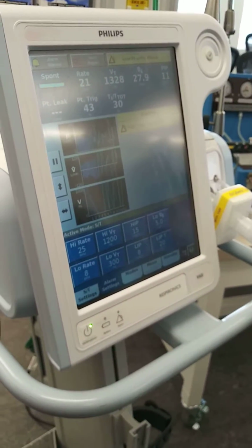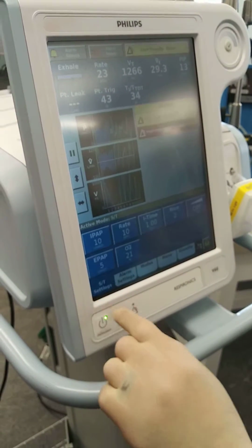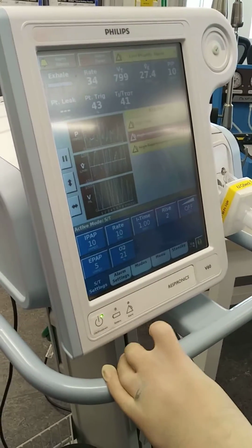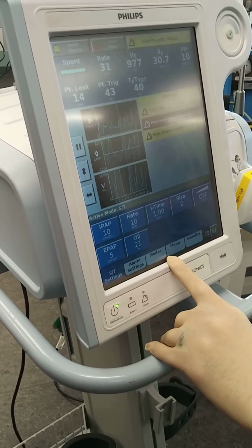Now we're really going up, to lower your CO2. Okay. I don't think we do MVV on a V60. No, on a V60, right?